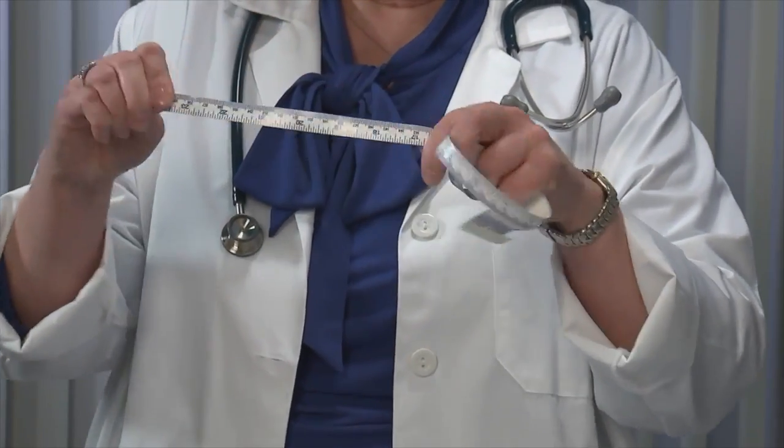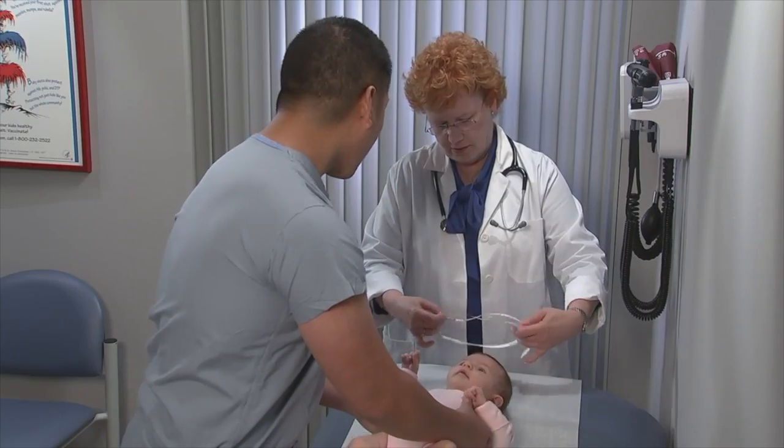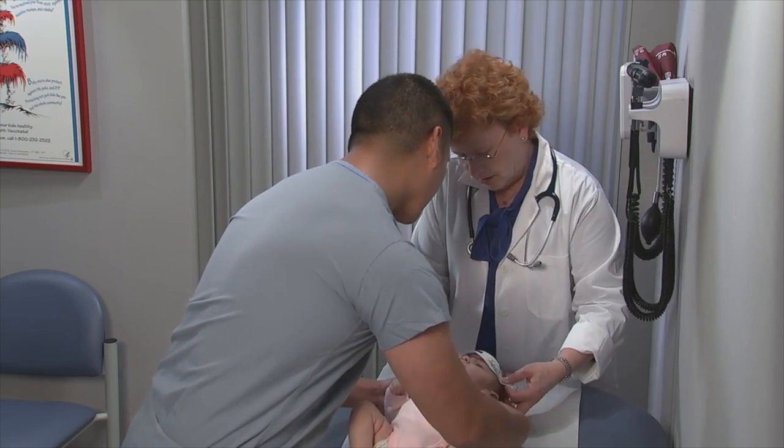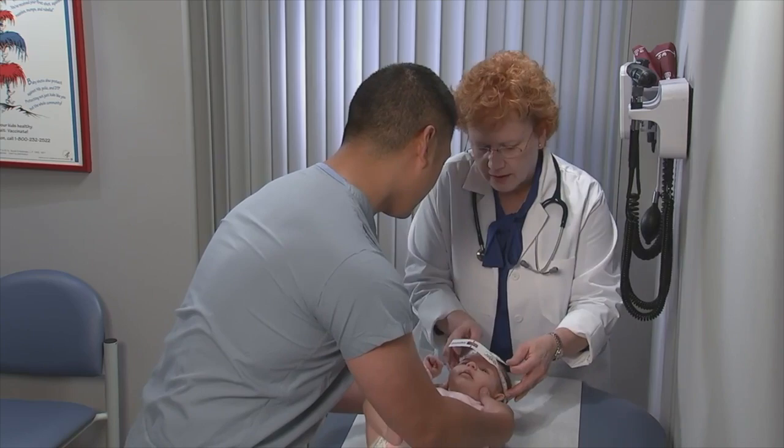Measuring head circumference isn't always as simple as it sounds. Let's review important considerations and methods now. First, start with a measuring tape that cannot be stretched. Next, securely wrap the tape around the widest possible circumference of the head.